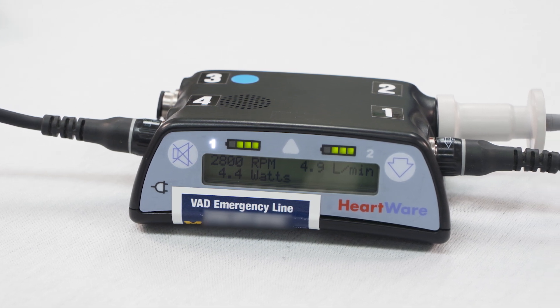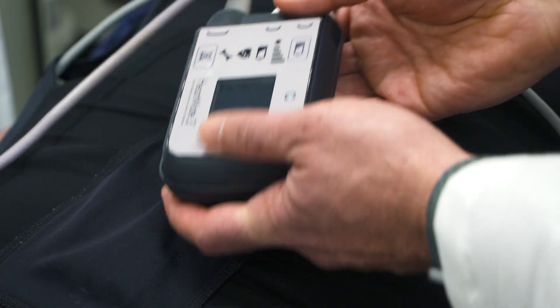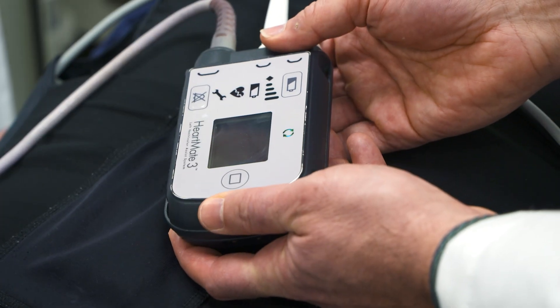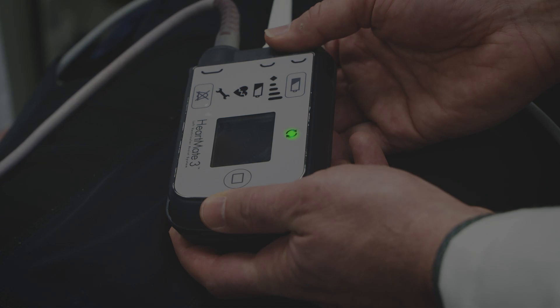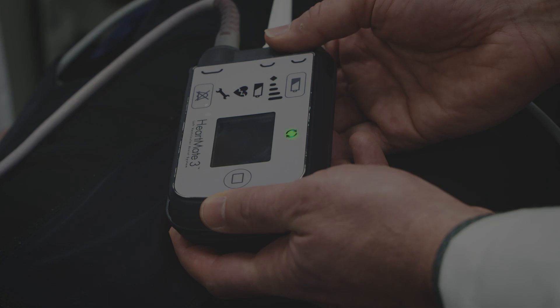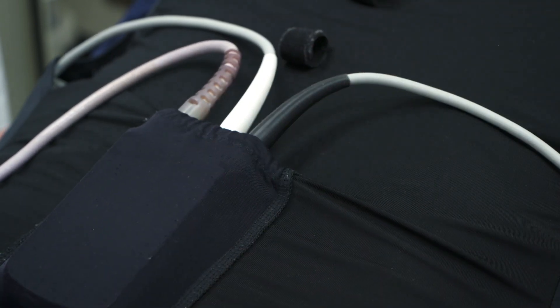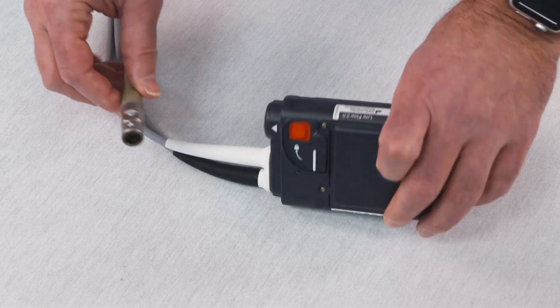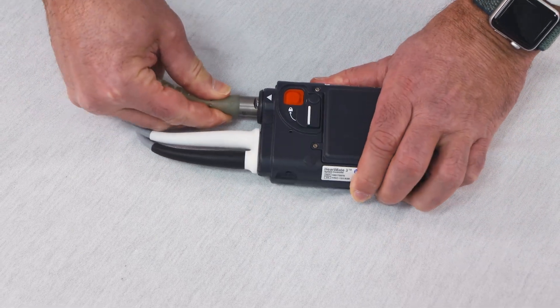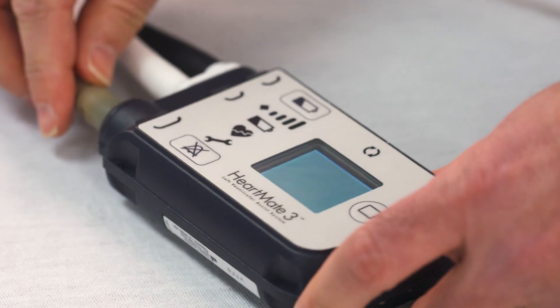When you arrive at the patient's bedside, identify the controller of the VAD and check to see if the device is on. In a patient with a HeartMate device, check to see if the green symbol is illuminated on the controller. If it is, the device is on. If not, here is how to reconnect the driveline and the power supply.